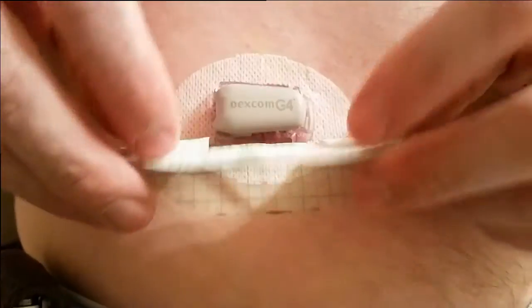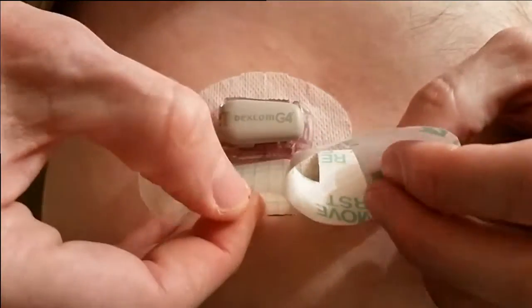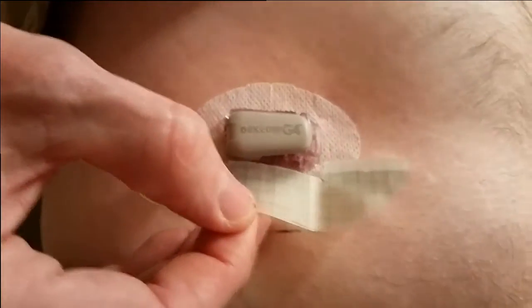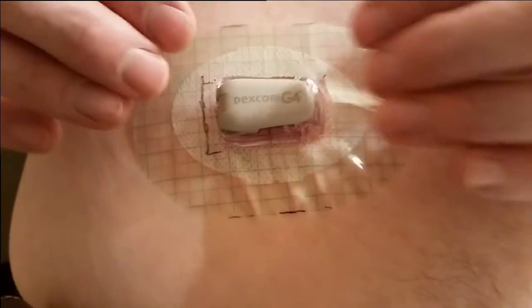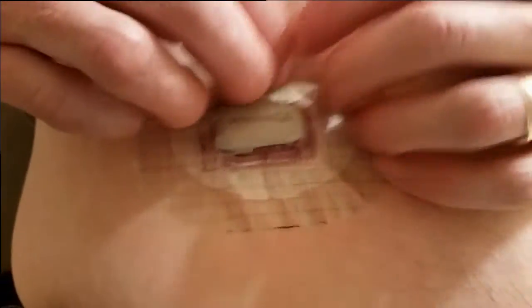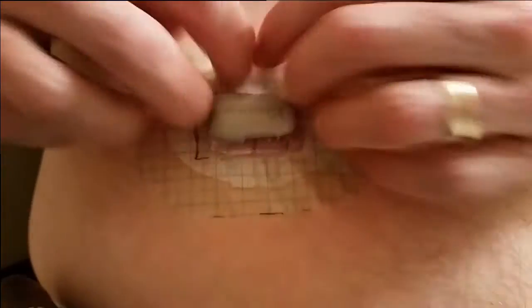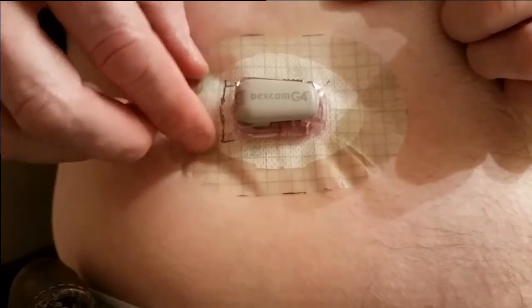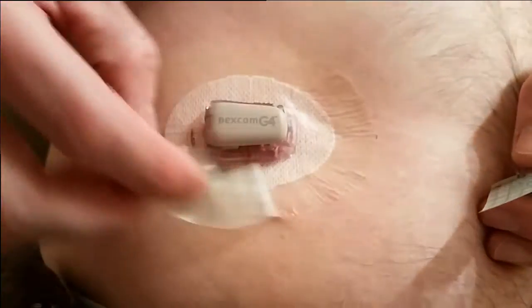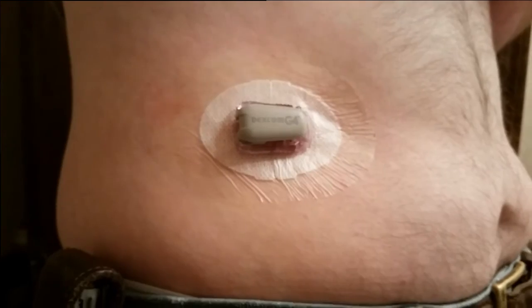Now pull it back off, just the top part, get the sticky part off of the top piece. Try to touch it in as few places as you can, and then push this back over the sensor. Stretch it out so your skin is nice and taut, and then stick all the rest of it down, nice and sticky. Once you think you've got it all stuck down everywhere, you can grab these little half pieces and peel off the covering on the outside of this stuff. And you're left with, ta-da, a very nice sensor installation that should be good for a couple weeks. Hope that helps everybody.